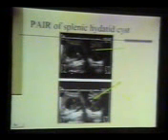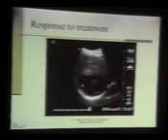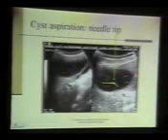This is the PAIR procedure of a splenic hydatid. Another case of a liver hydatid, partly responding to the treatment. Partly the membrane is collapsing inside. That is the membrane floating, the water lily sign.